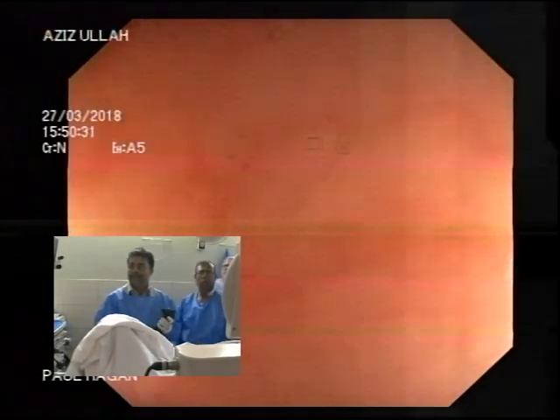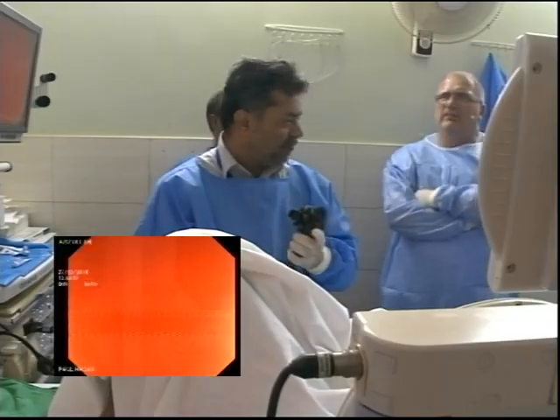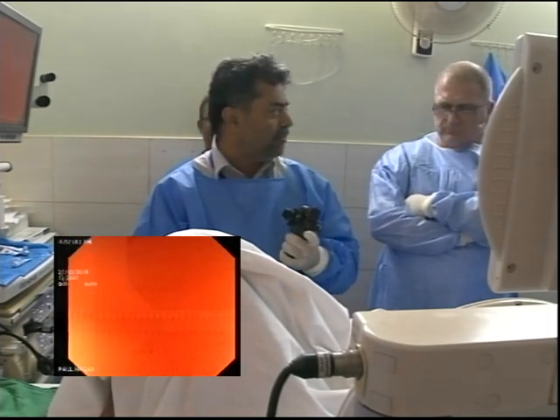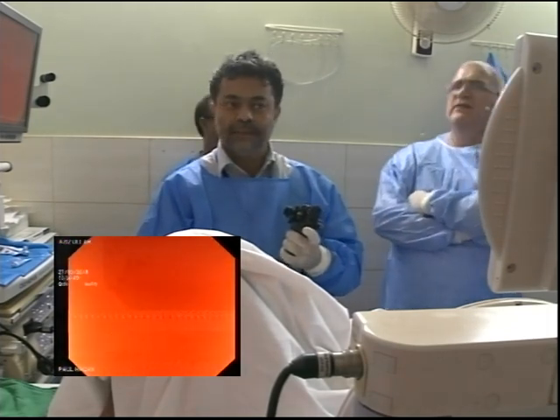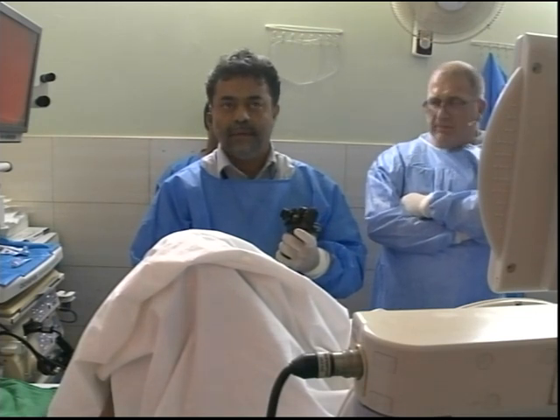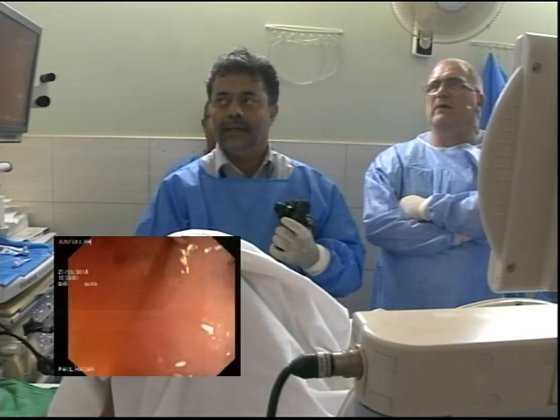Now, you change position. What do I get you to do when you've changed position? I just retrieve 1-2 centimeters. A little bit more. And wait, because you're still against the wall. Yeah. Continue to draw back. But there's no air? A little bit of air. You need a little bit of air. Okay. Good. Now you can see where you want to go.